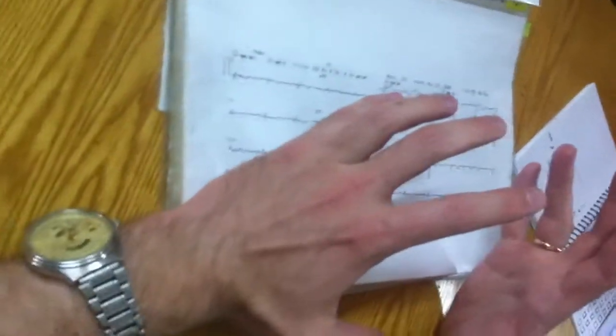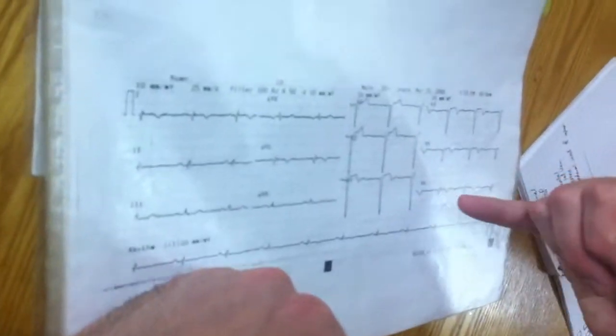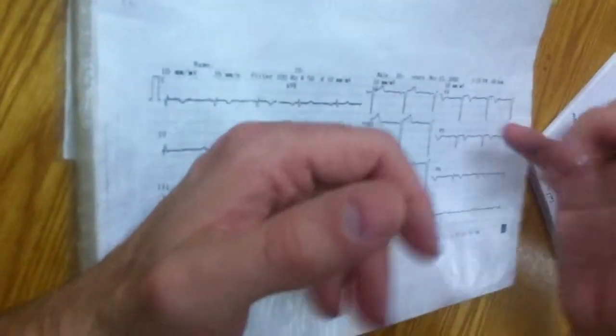And then you conclude. So these changes are mostly characteristic for myocardial infarction of the, for example, septal, anteroseptal, anterior, and apical and lateral walls, in the subacute stage. You just list which places, and you then write the stage. So it says about the subacute stage, and it will be your conclusion.